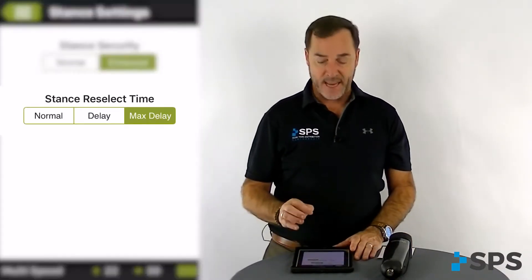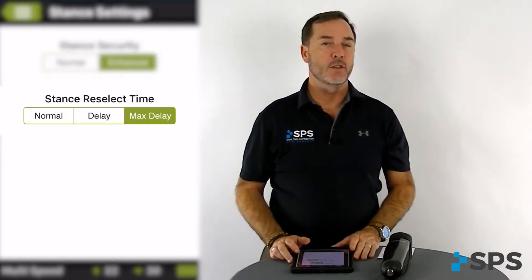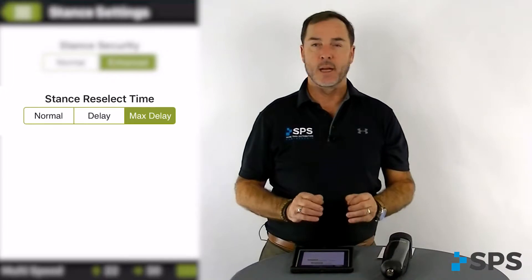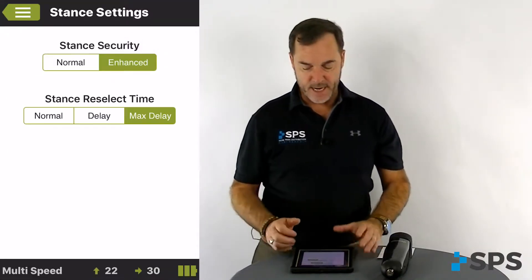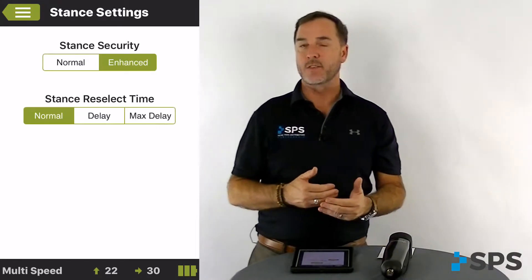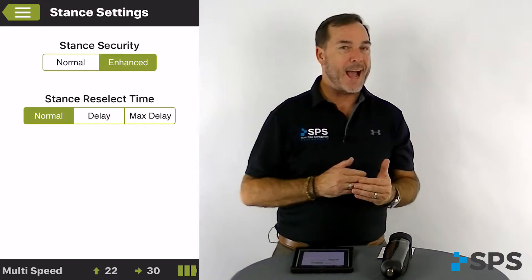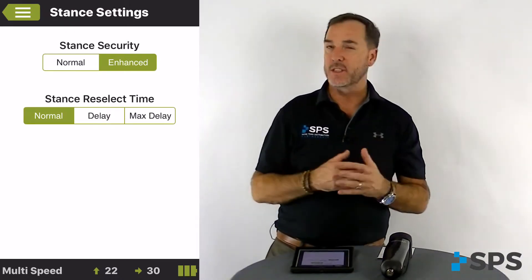Under stance settings, we also have the stance reselect time. This is a very unique feature to the Orion and Lynx family of knees. Stance reselect time is when the patient meets all the requirements for swing phase but doesn't initiate swing flexion. All microprocessor knees will revert back to stance phase in a certain period of time, usually between a half to one second.